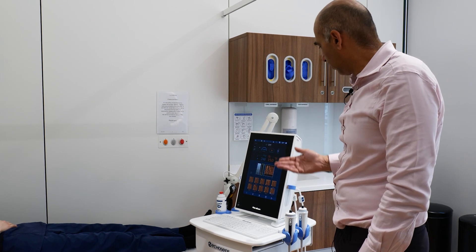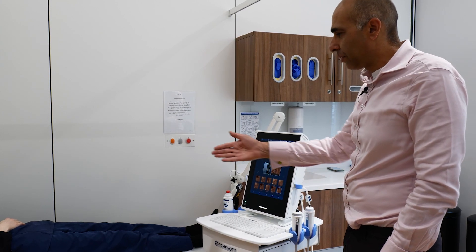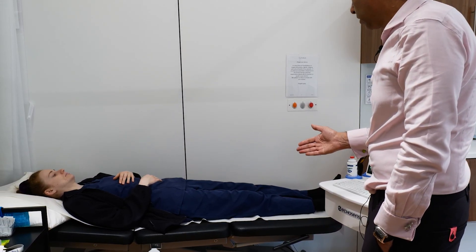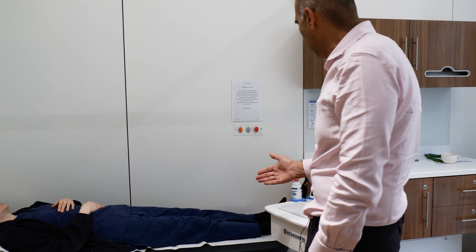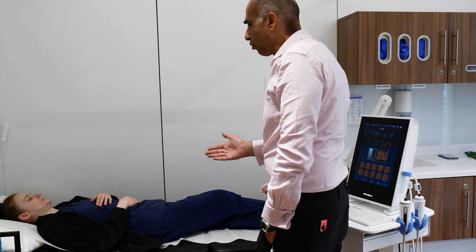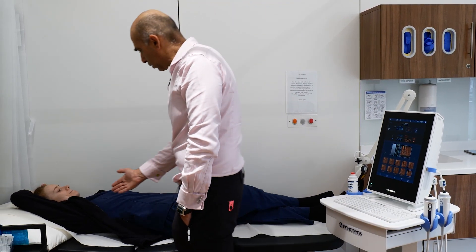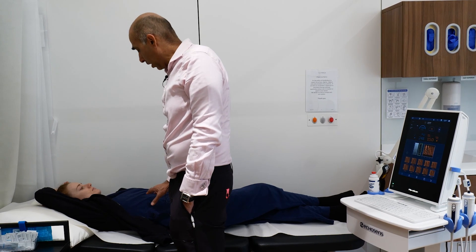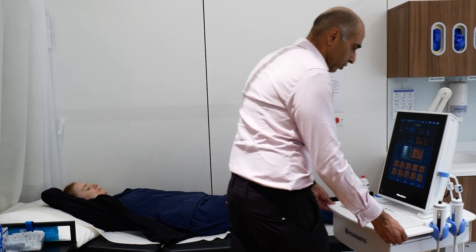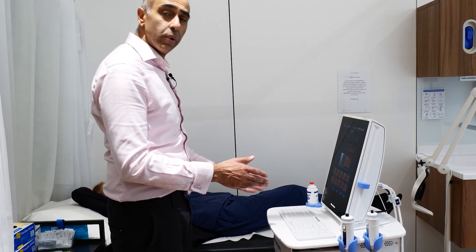This is the FibroScan machine — very straightforward. There's a screen, a keyboard, and two probes. The patient lies down, and we ask two simple things: first, cross your right leg over the left one; second, put your right forearm behind your head. This gives very good access to the ribs, as your liver is on the right side. We lift up the shirt, apply one of the probes to the skin, and take ten readings before we get an answer.